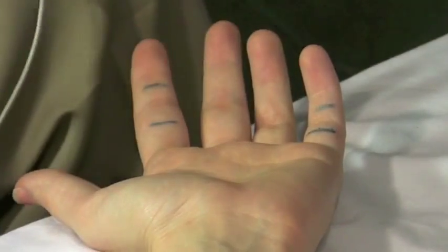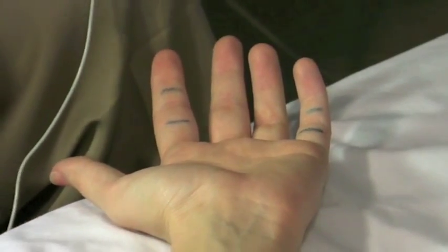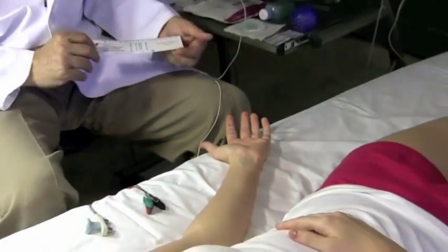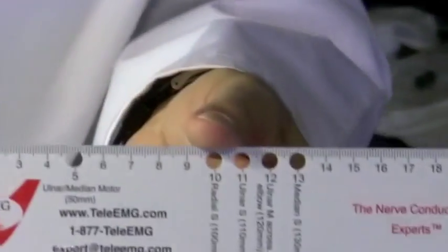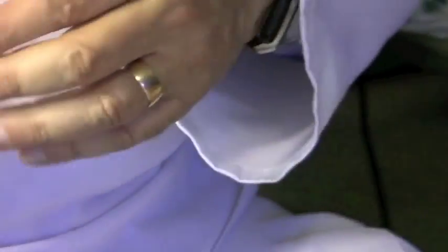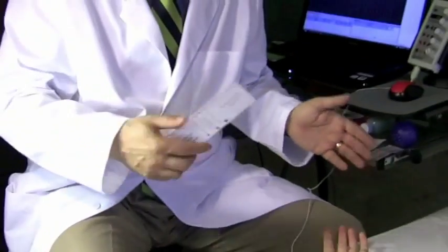And now I'm going to measure. Here's this nice ruler that we've created just for that, and it has the measurements that we use for each one of these nerves. Now, why do we use measurements? Simple, because if you're stimulating a nerve from far away, you're not going to get as good a response as you are going to get from closer to the recording electrodes. So you have to decide what distance you're going to use.